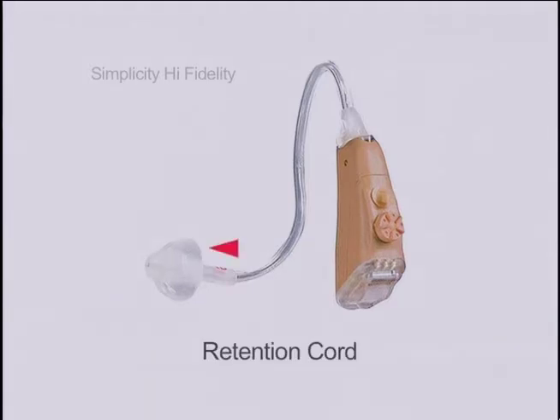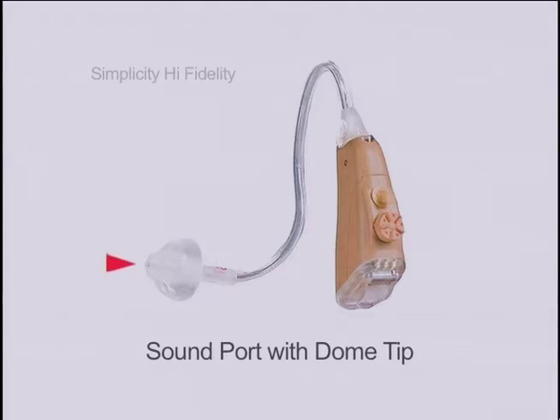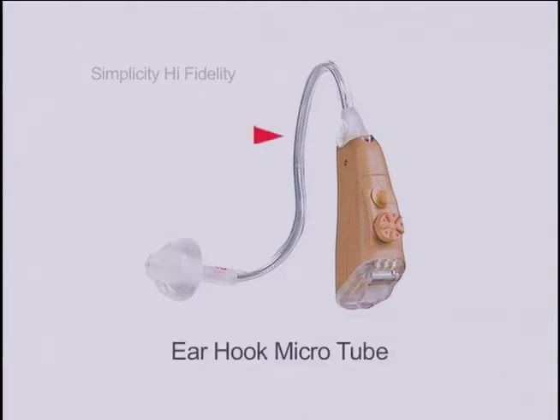The retention cord, the sound port with dome tip, the earhook micro tube, the microphone port, the speech and noise switch, the volume control, and the battery compartment.